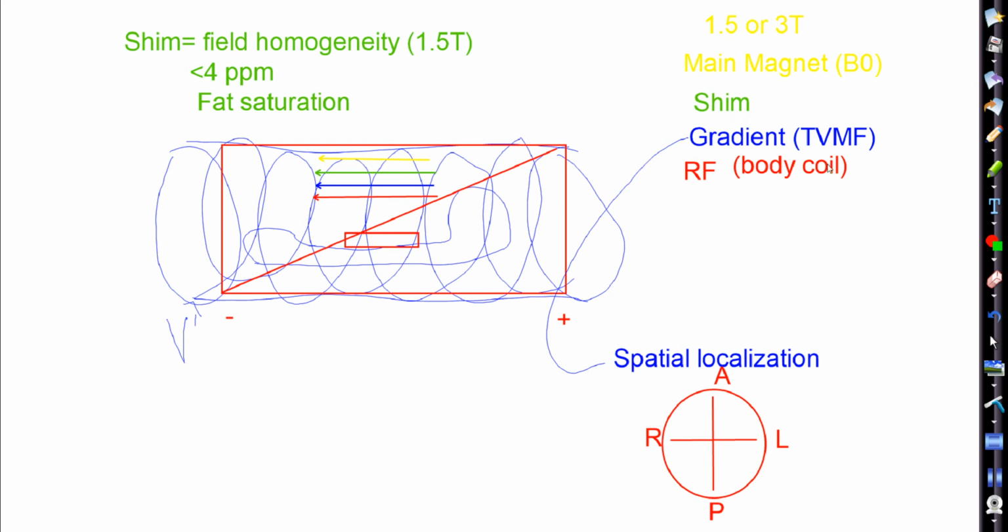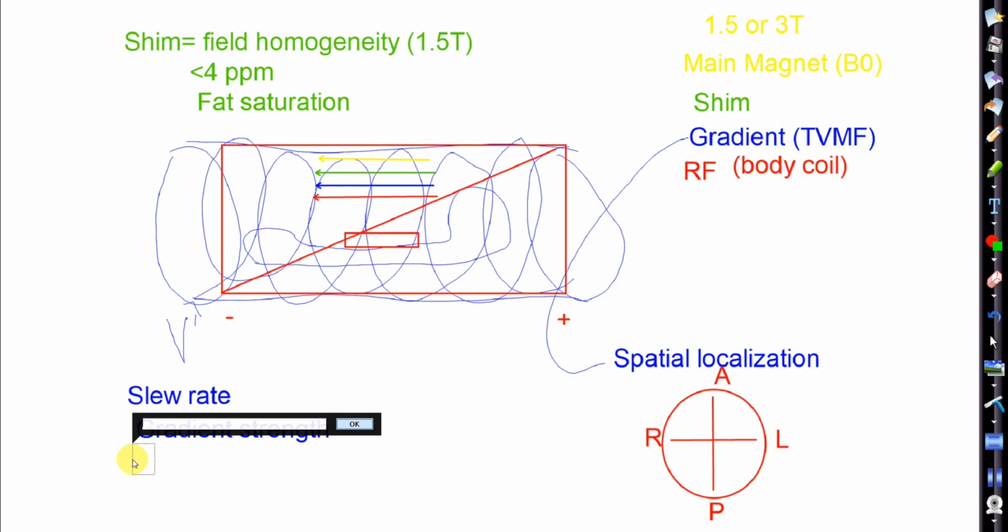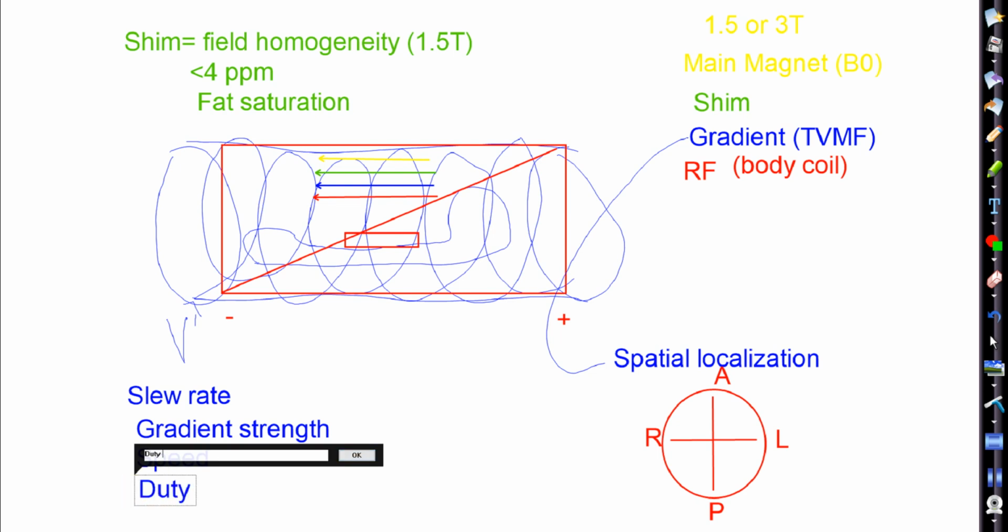So we talked about these 3 things, so we're really going to hit on RF, and that will be it today. When we were talking about the gradients, we had a couple definitions we needed to know. What were those definitions? Slew rate was one. Strength, amplitude or strength. Speed, right? And then what was that last one? Duty cycle. There you go. Do you know the units for each one?